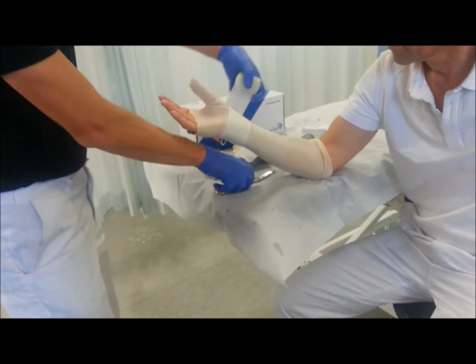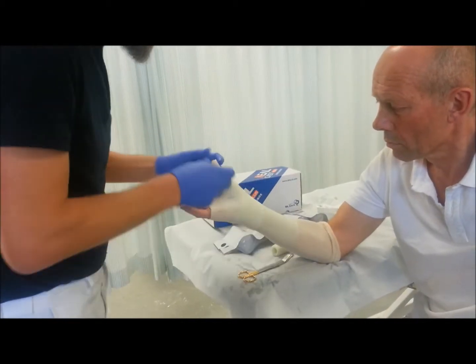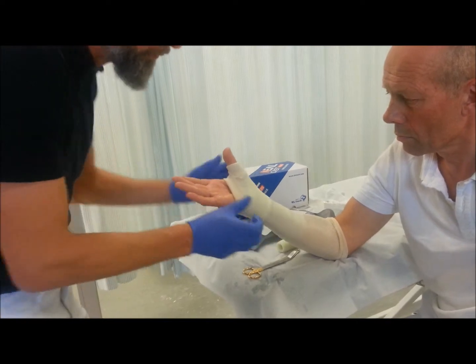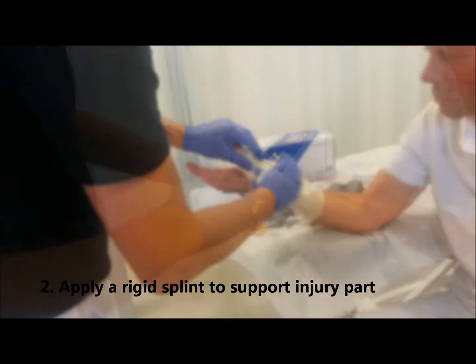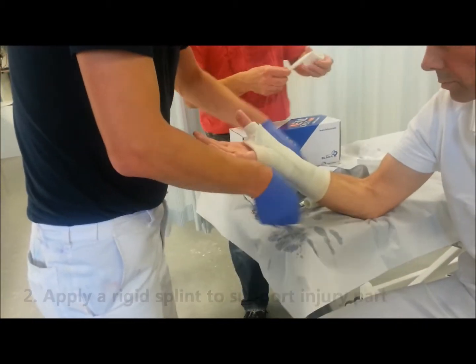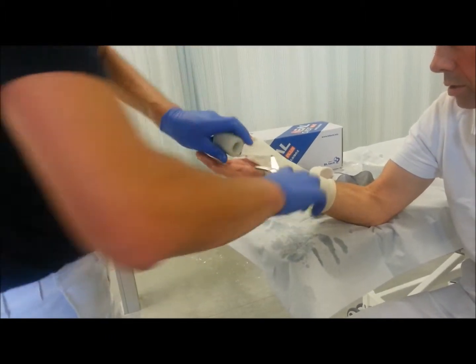Is it a rigid one? This is the semi-rigid, so the soft cast. The application of the cast is very important, but also the stockinette, because when it's removable — so this one is a soft one? Yes, again the soft.